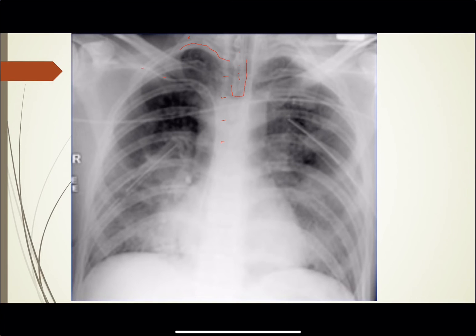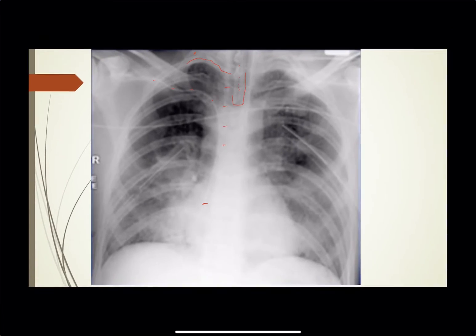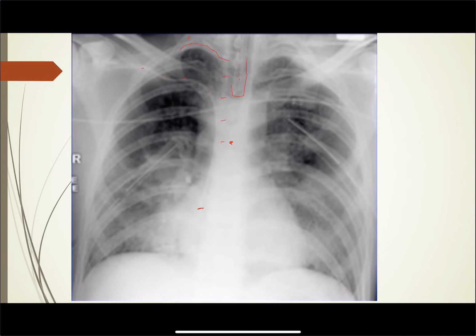You can see some other stuff going on here — a line coming here that appears to be a right subclavian. It comes down and looks like the tip is right about here, so that's probably a little bit too far. Counting: T2, T3, T4, T5, T6 — so your carina is going to be right in this area. You want the central line to be about two vertebral bodies below the carina. Looks like we're a little bit below that — this line is probably down in the right atrium and needs to be pulled back.